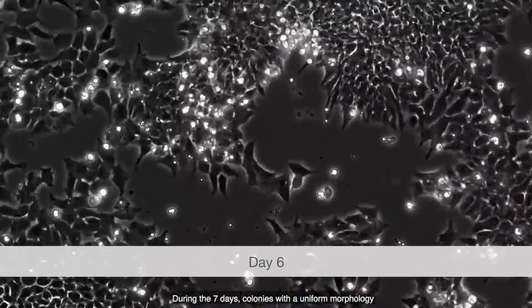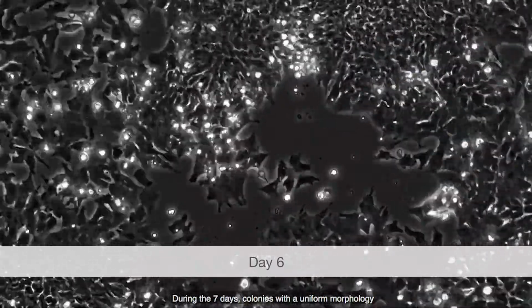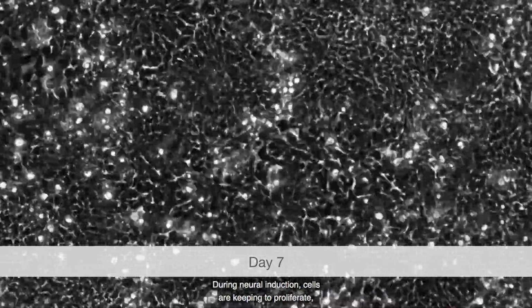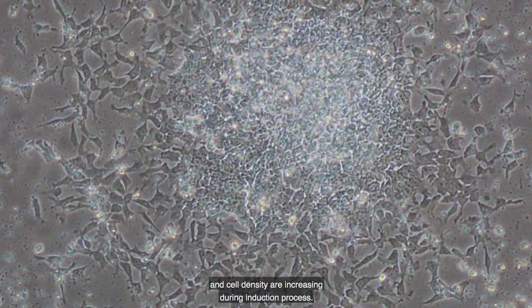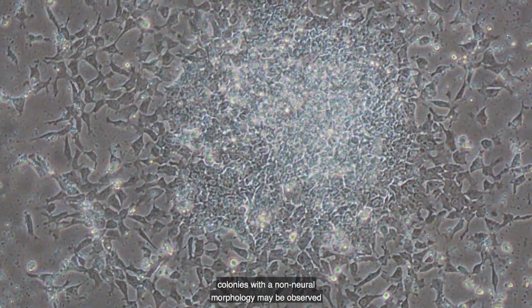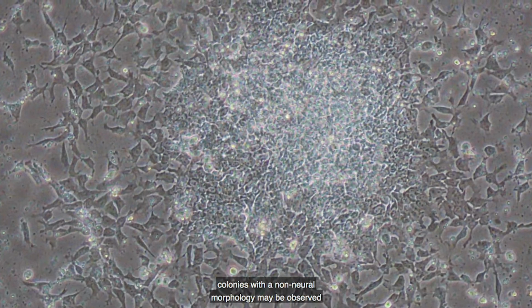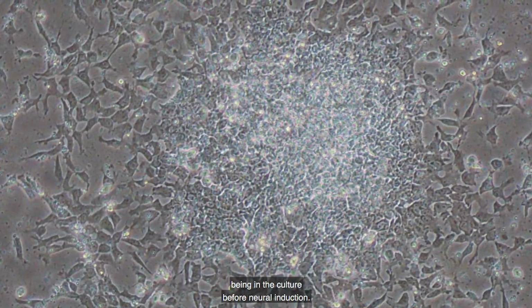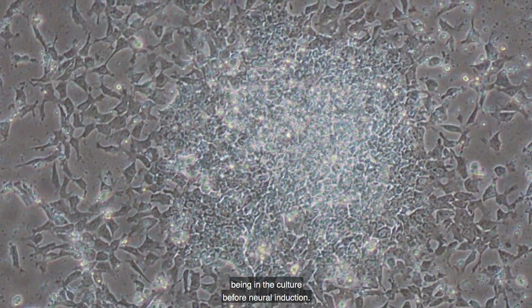During the 7 days, colonies with a uniform morphology indicate good neural induction. During neural induction, cells keep proliferating and cell density increases during the induction process. As shown in the images, colonies with a non-neural morphology may be observed during neural induction due to differentiated PSCs being in the culture before neural induction.